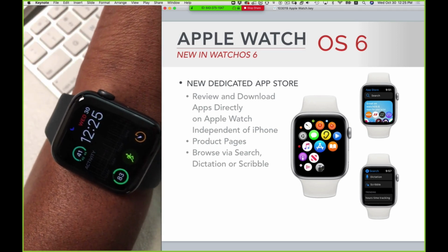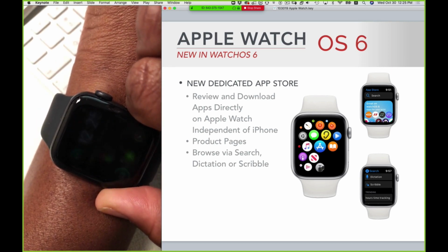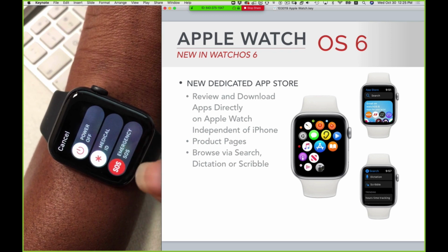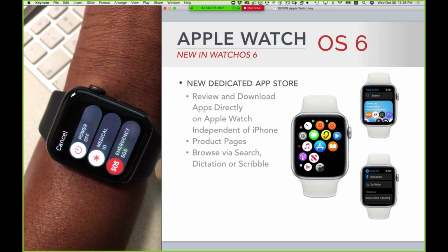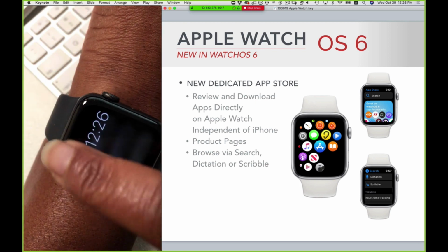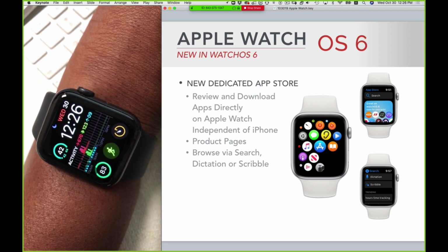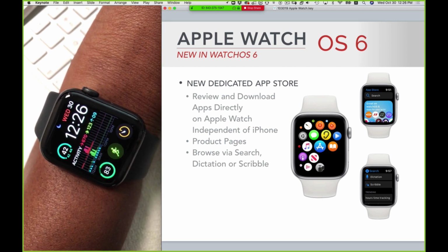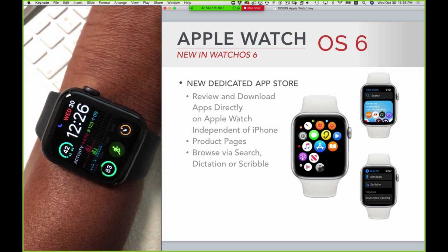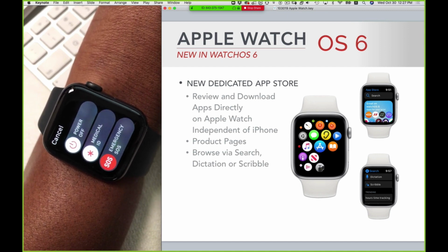But there's one thing I might be able to show you without setting this off. If I press the side button long enough, there are several things you can do here. You can power off, show your medical information, or contact emergency SOS. I'm just going to cancel out of that. So there are ways for you to get help. If you haven't fallen and you need to, you just press the side button. Or when you do fall, it will alert you and give you an opportunity to press "I'm okay" or "I need help."